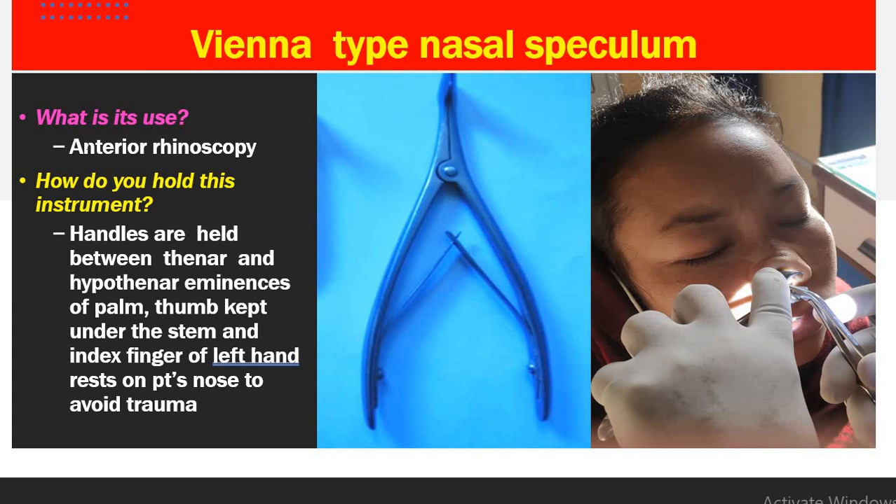The Vienna nasal speculum is used in anterior rhinoscopy and during septal surgery — either SMR or septoplasty — to make the incision. The handles are held between the thenar and hypothenar eminences of the palm, with the thumb kept under the stem. The index finger of the left hand rests on the patient's nose to avoid trauma. The speculum is always held in the left hand during examination, with the right hand free to use forceps for packing the nasal cavities.